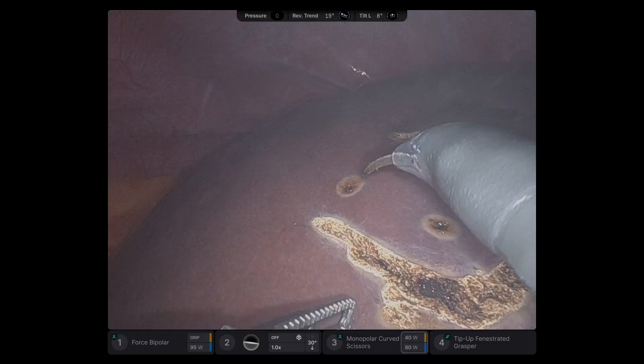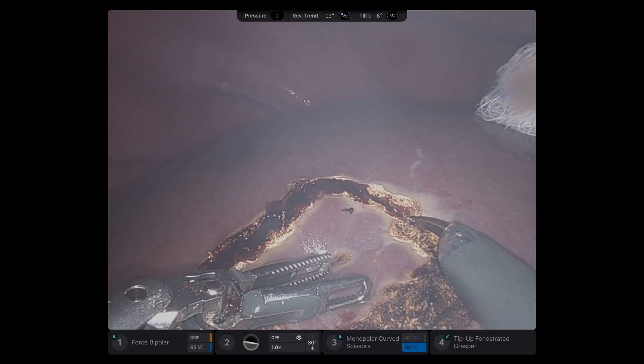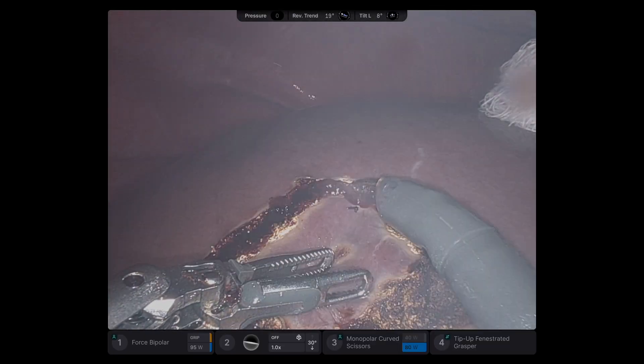The bump under the patient helps pull the liver down. If this was a posterior segment 7, I would use a lateral position.